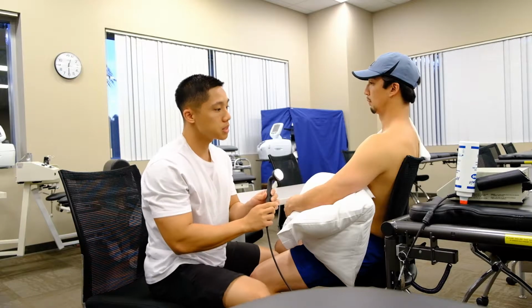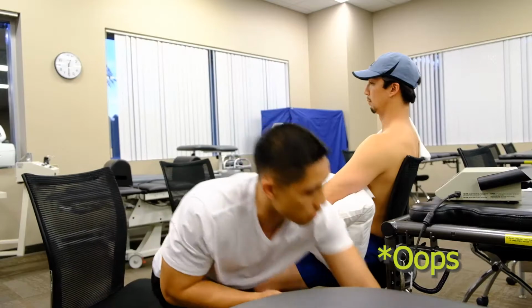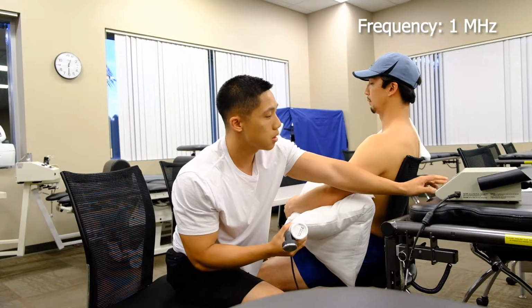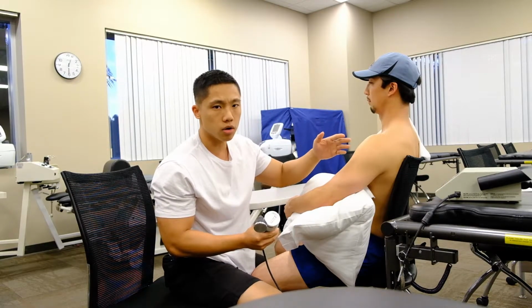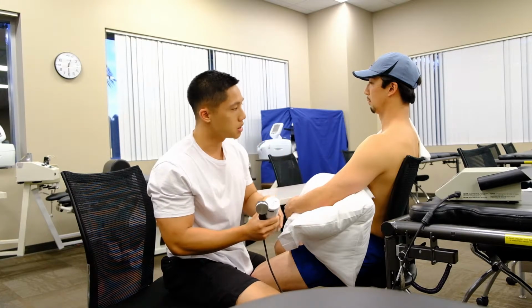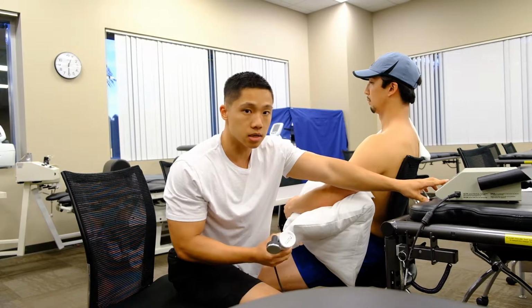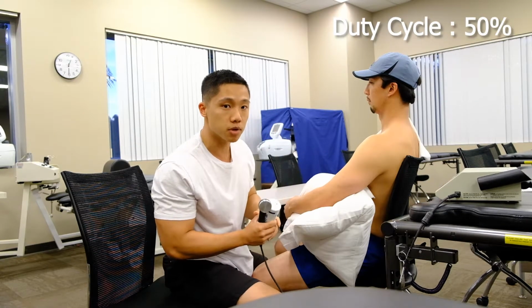I'm going to be placing the frequency at 1 megahertz right here to address the fibers of the trapezius, which are large and broad. So I want to go ahead and reach the deeper fibers to address the swelling. For the duty cycle, since the patient is in a subacute stage, I'm going to put it at 50%.